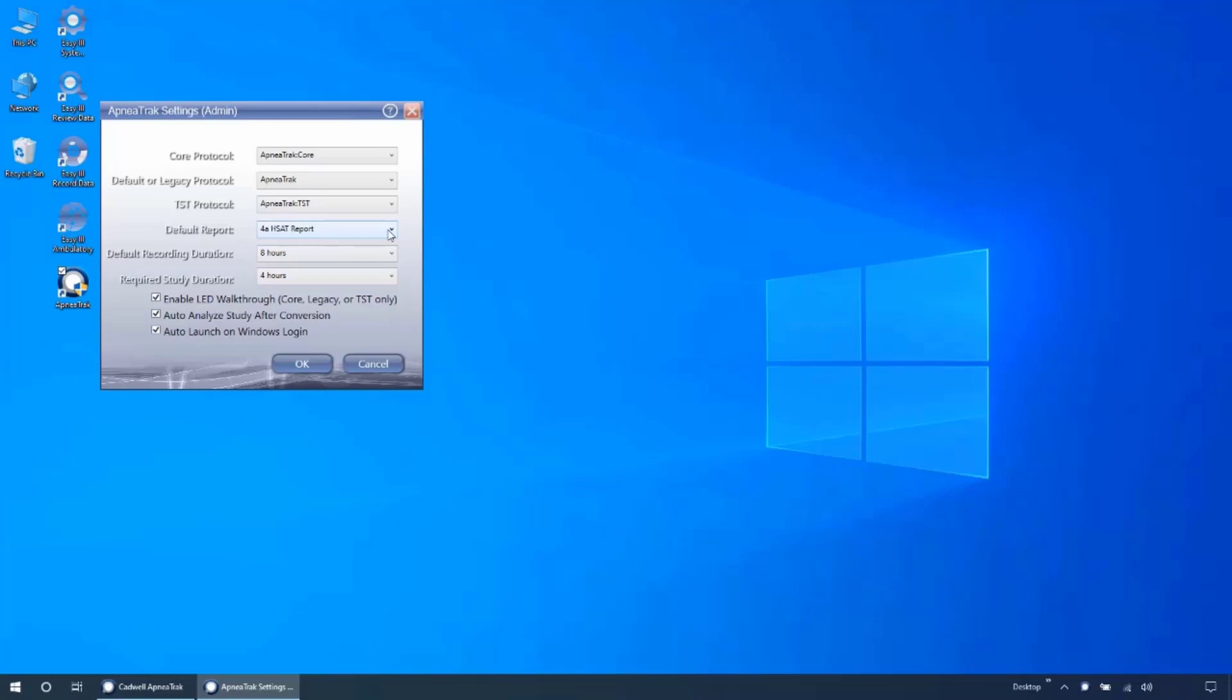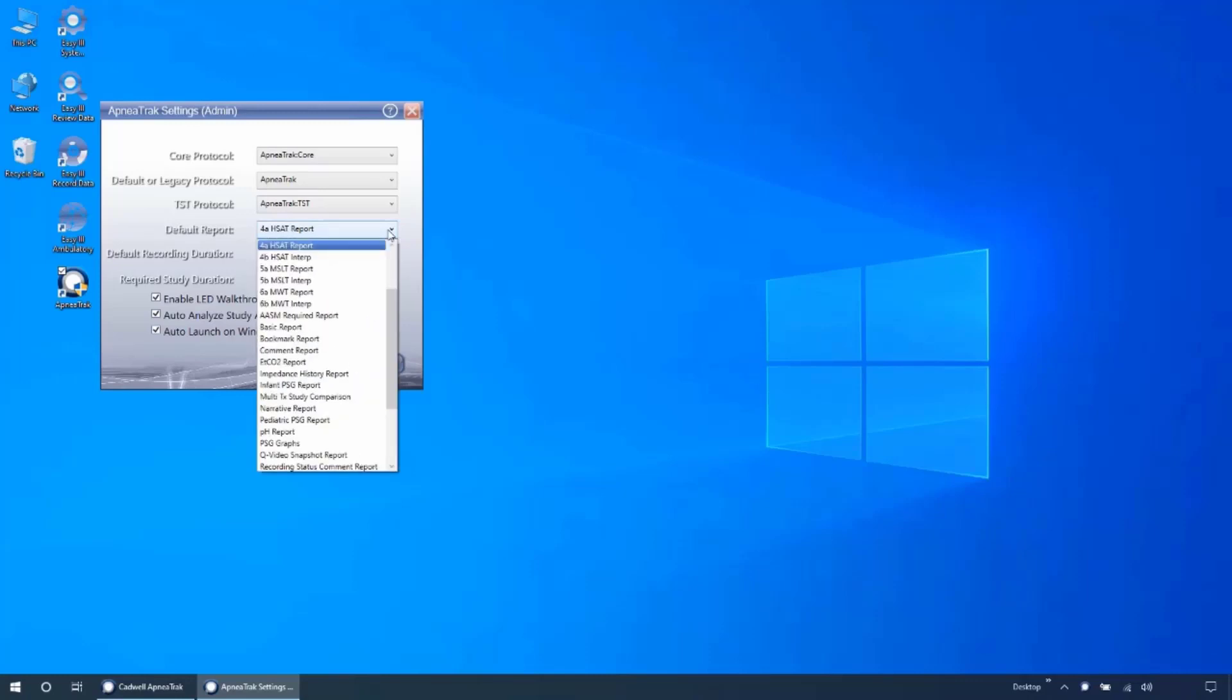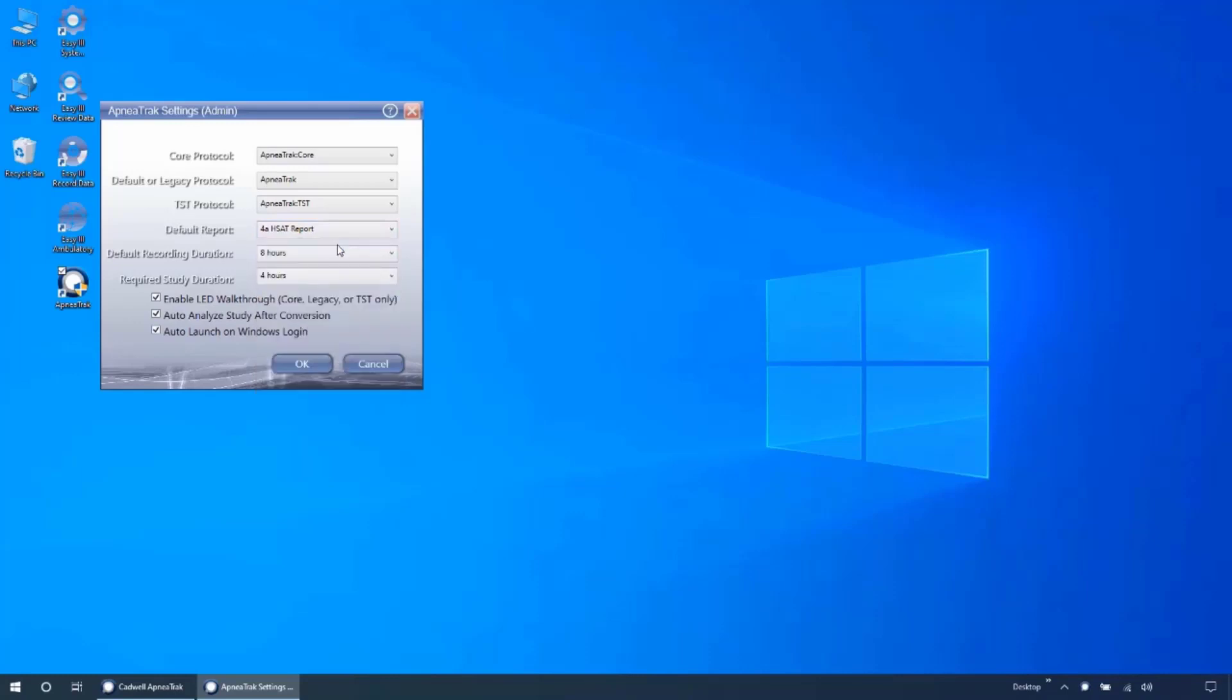The default report will allow you to specify which report is run when clicking the default report button from your ApneaTrak status window. The default recording duration will determine which duration is selected when you first open the initialize ApneaTrak recording window.